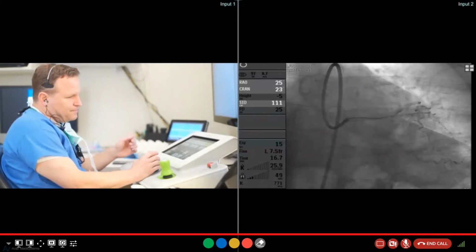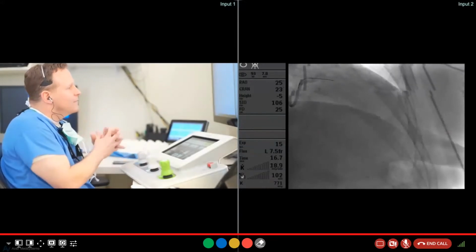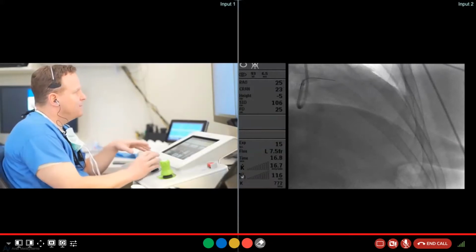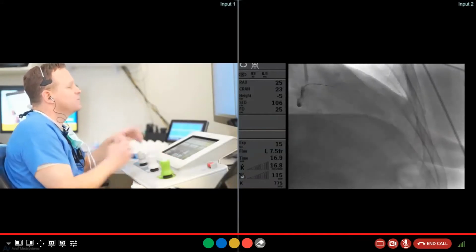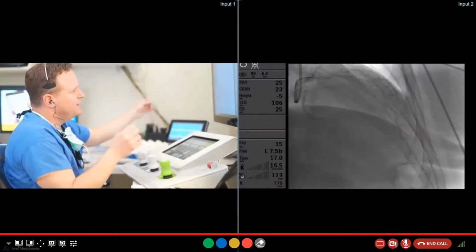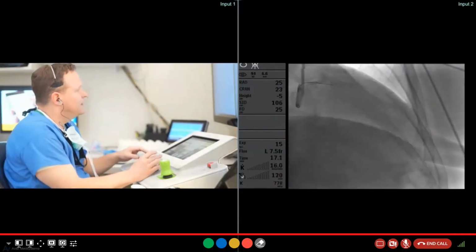So right now you're going with the pressure wire. Correct. Yes. And you are going to be normalizing, flushing, and then we'll be doing physiology assessment. We actually equalized right before we got in, so I'm going to go ahead and go in. We may be a little damped, so I'm going to pull the guider back just a touch. Okay, perfect. And Sam, can you give me just a touch of the flush? For sake of time, I equalized outside of the left main ahead of time, so we're already equalized. We're going to go down, flush up the system, and plan to do a DPR assessment. What do you think? Perfect.